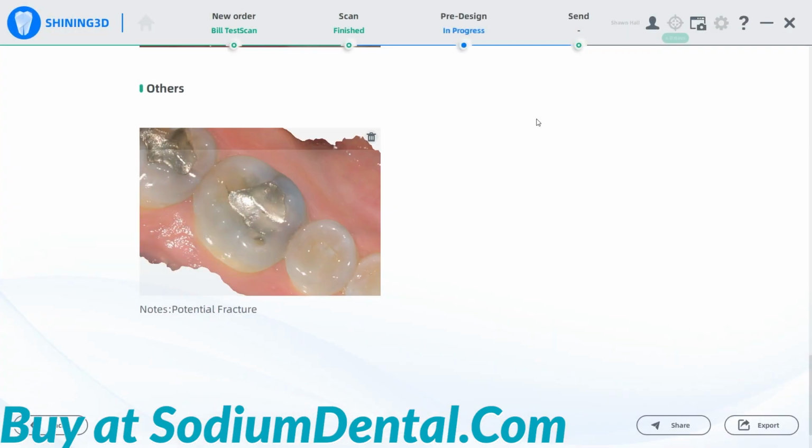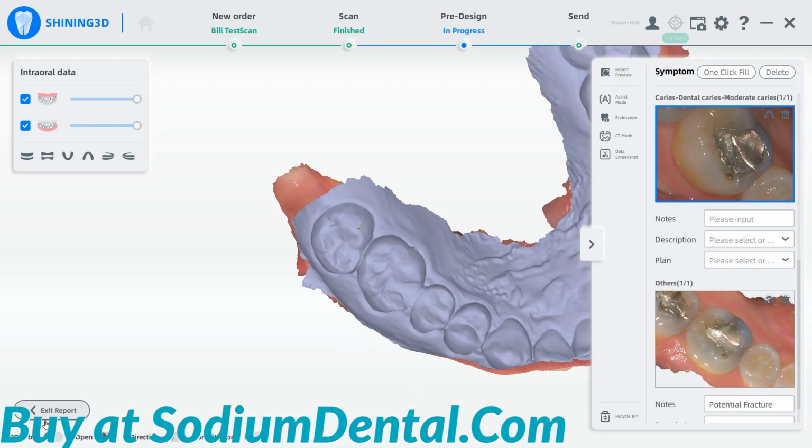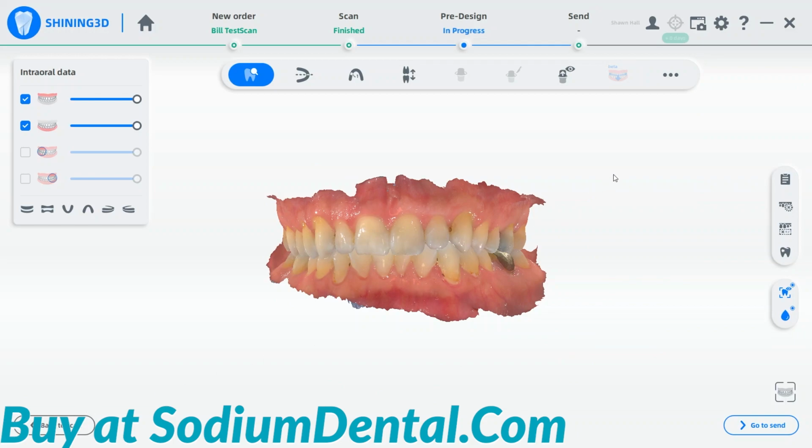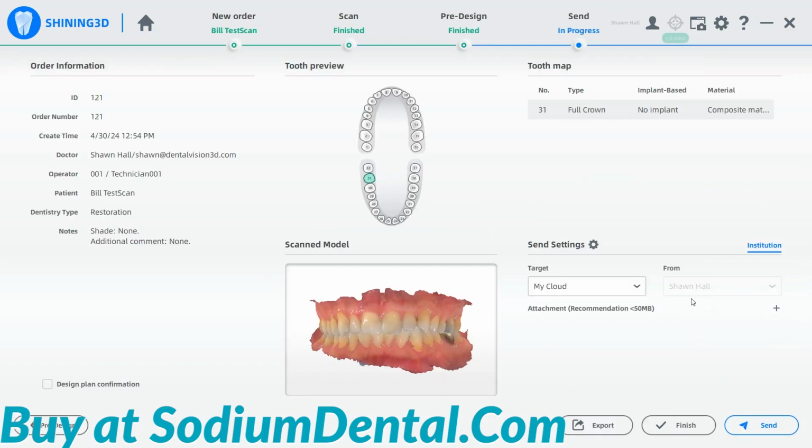You can close out of this and go back, exit the report. And now we are also ready to send this digital impression to the lab of our choice. My target lab is going to be my cloud, but you can add in your own labs.